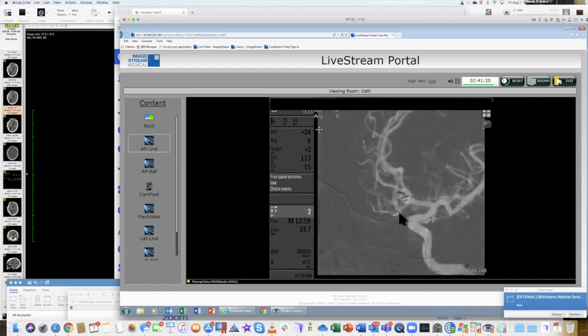Someone asked, can coils move out of place? He got it in. Incredible. I don't know if he's going to get any more. And this little loop right there is a little bit close, but I think he's okay. Let's see what he's doing with his hands down below.